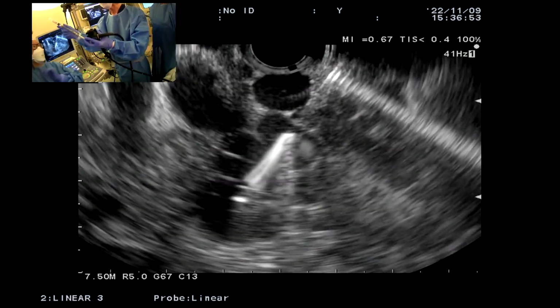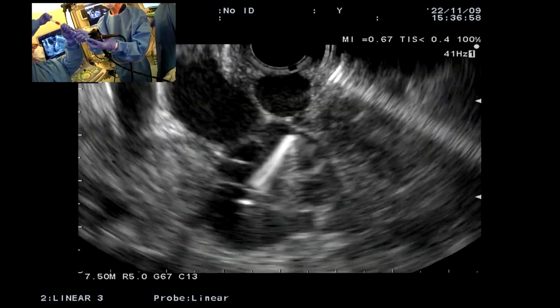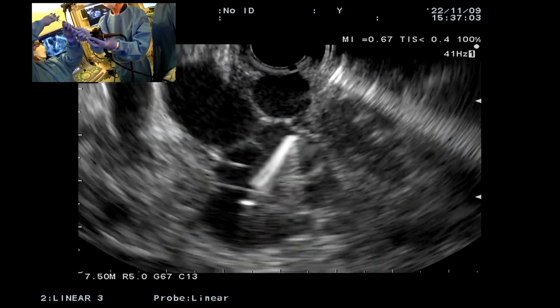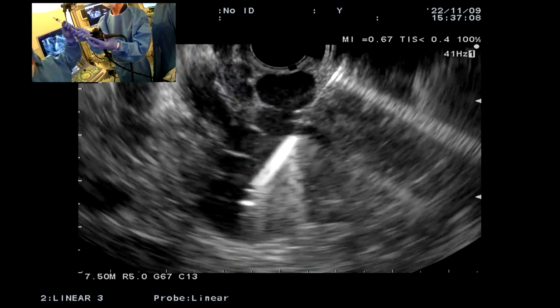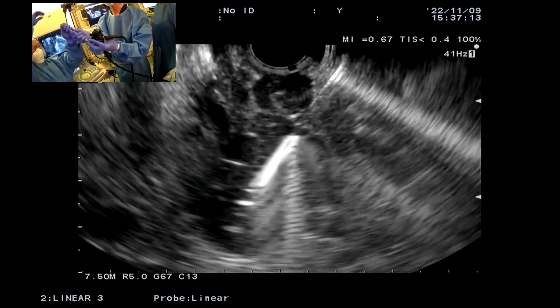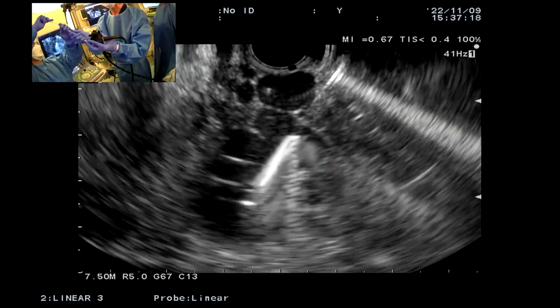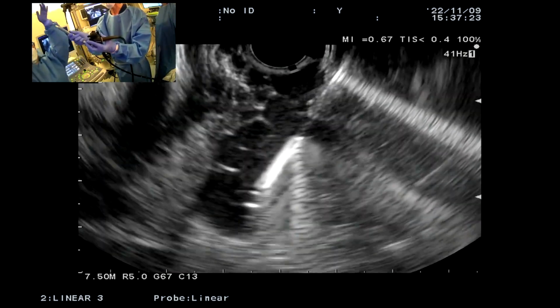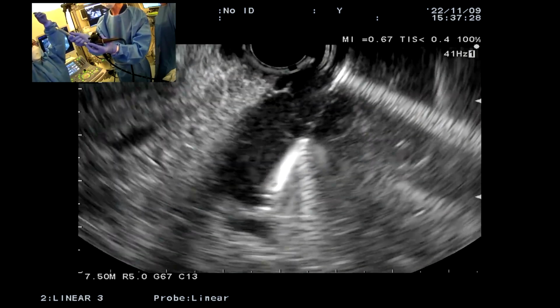I'm inside. We're going to aspirate first. We're waiting for blood flow. The assistant's holding the scope in position, looking at the screen to make sure things don't change. Did you get blood return? Yes, I did. Good. We're going to inject a little saline just to see the bubbles. There it is. Very good. Now you see it flows immediately into the collateral areas, right? You see that. This is why we're putting these coils in there, to catch that glue when we inject the glue. We don't want that glue embolizing. Go ahead, please. Yeah, continue.